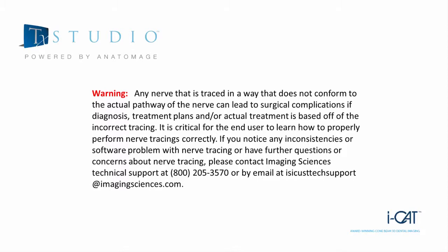If you notice any inconsistencies or software problem with nerve tracing, or have further questions or concern about nerve tracing, please contact Imaging Sciences Technical Support at 1-800-205-3570 or email us.